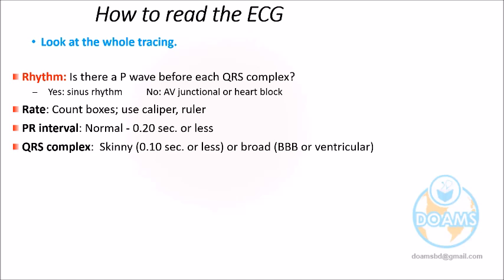It will be more than 3 smallest squares to be confident, because broad QRS is an abnormal finding. So traditionally, more than 3 smallest squares. We cannot say that less than 3 smallest squares is normal. There is a gray zone of 0.5 square. Sometimes the physician can understand by correlating with the clinical picture, even just near 3 squares may be significant. For this reason, in between there is a gray zone.